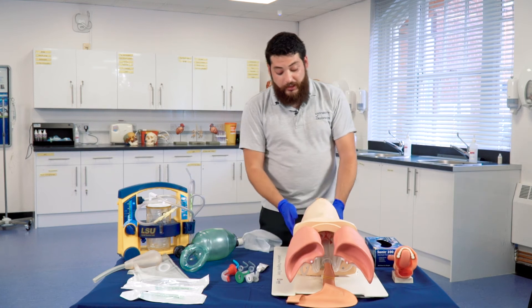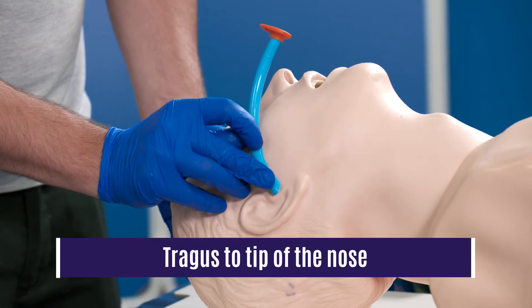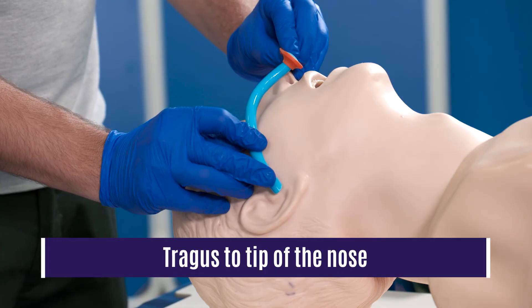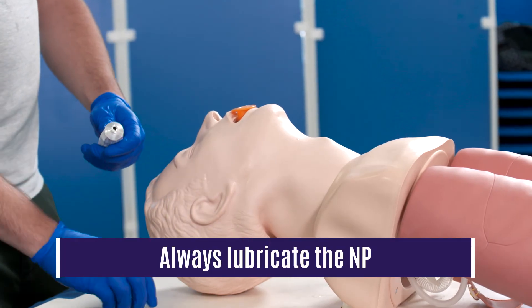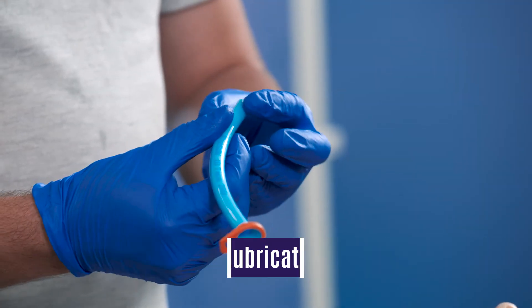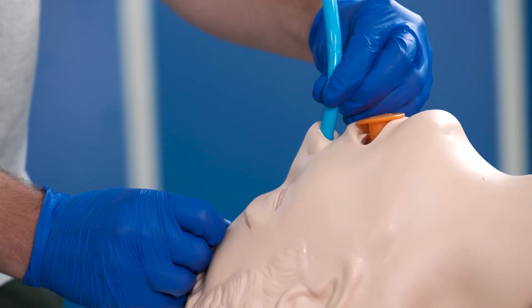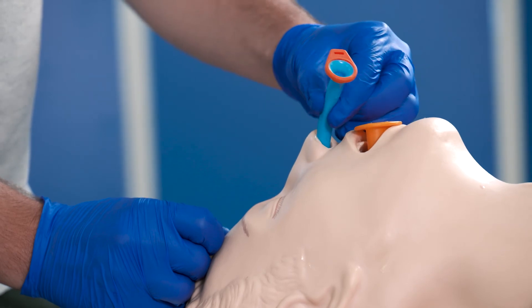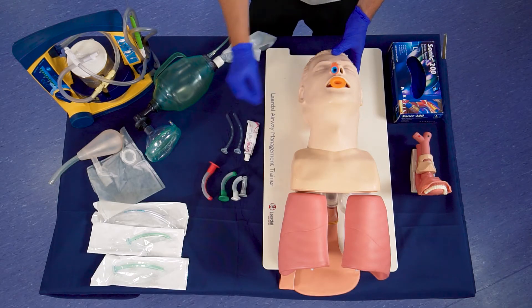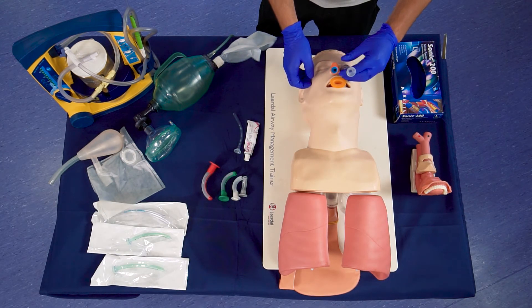When we use NPs, it is the same size up — this is from the middle of the earlobe to the tip of the nose. As you can see, this NP has a bevel and this bevel is directed towards the septum. Because the nasal passage is very vascular, if you do come across resistance, it is best not to continue pushing further as you will create active bleeding. So in this case, we are doing two NPs and an OP.